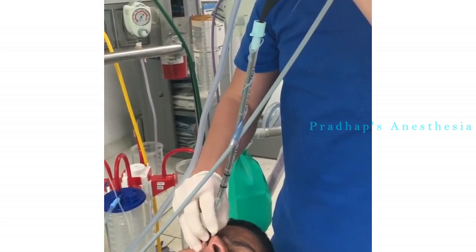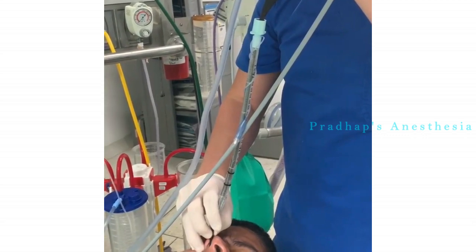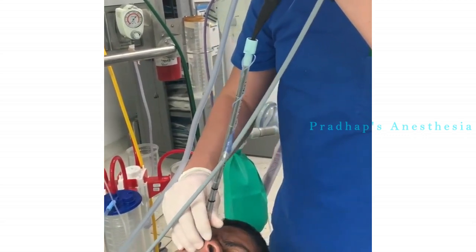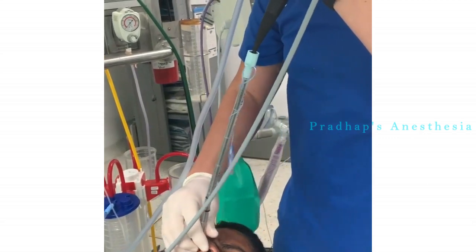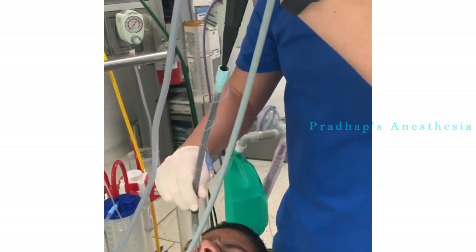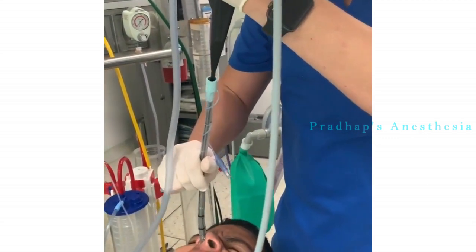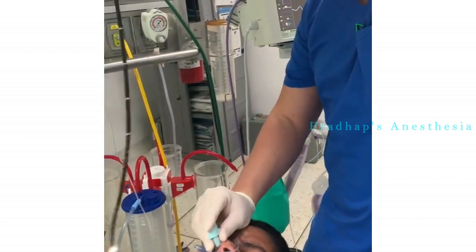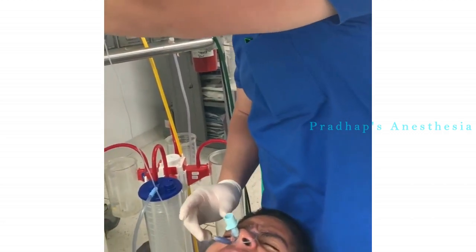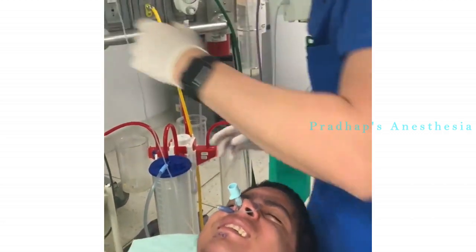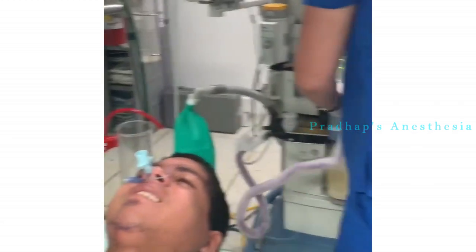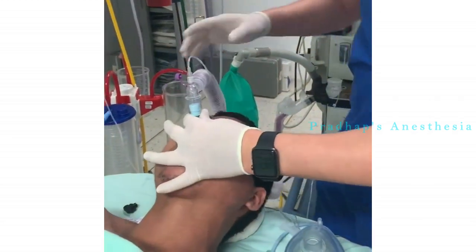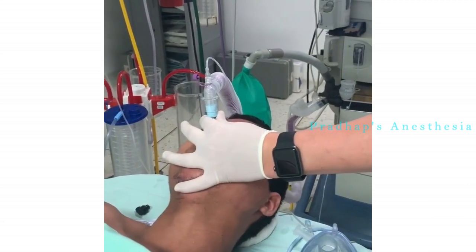The scope was then advanced through the glottis opening into the trachea. The tip of the fibroscope was positioned proximal to the carina, and the nasotracheal tube was smoothly advanced into its correct final position, as confirmed by the presence of positive end-tidal carbon dioxide and auscultation of bilateral breath sounds.